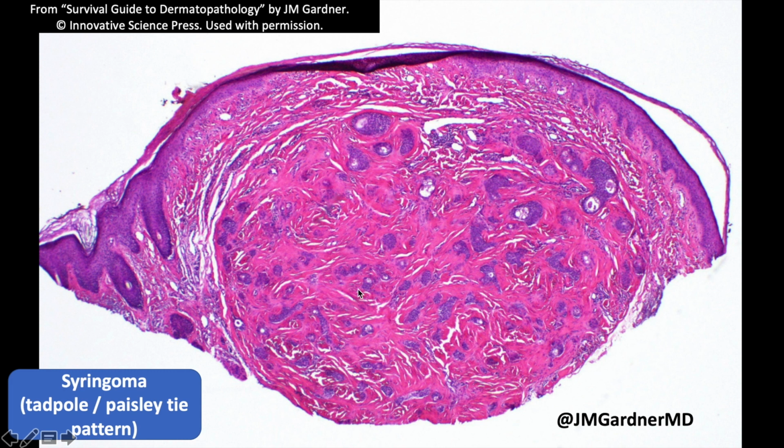They tend to have a dense sclerotic background stroma, and you can tell, like, here's where the end of the tumor is, right? That stroma is very distinct and discrete from the surrounding dermis. And even though if you look in the middle, it looks kind of busy and infiltrative, if you see the whole lesion from low power, you can tell that clearly it's circumscribed and it's not infiltrative.